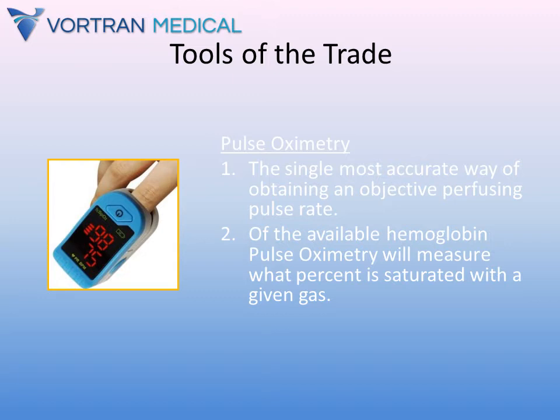Pulse oximetry also indicates the real-time boundary of your safety zone in a non-breathing patient. Remember, a patient that is not breathing with a pulse ox of 98% is an emergency, but a patient that is not breathing with a pulse ox of 80% is a crisis.